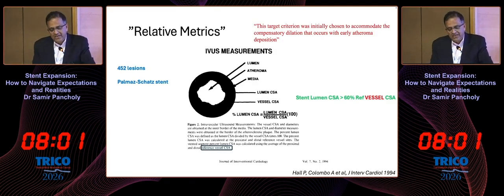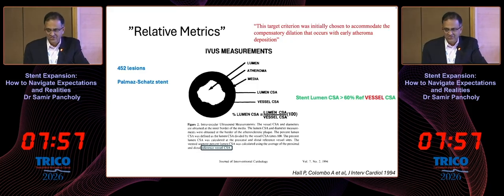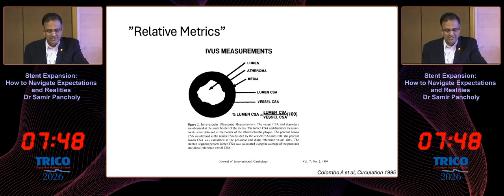Again, the confusion began right there. What is reference vessel area? We are all luminologists. We don't look at EELs on our angiograms. And so this EEL concept was restricted to people who are using IVUS at that time.